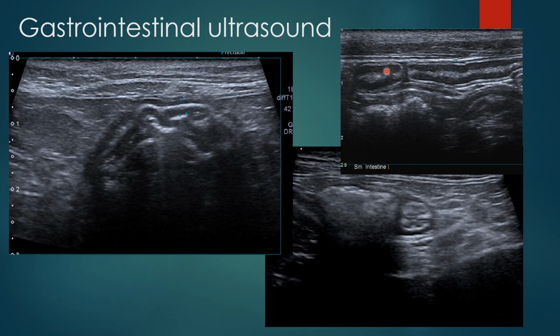Okay, when I'm using these terminologies, transverse and long, I'm talking about the orientation of the organ. So your probe may be very oblique, it may be in a transverse or sagittal plane, but the image of the organ itself is in a longitudinal or sagittal plane. That means the same thing, or in a transverse plane here. So again, here's lumen. This is lumen here. Here is one wall, the more superficial wall, and here's the deep wall.